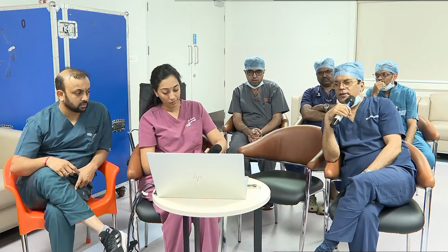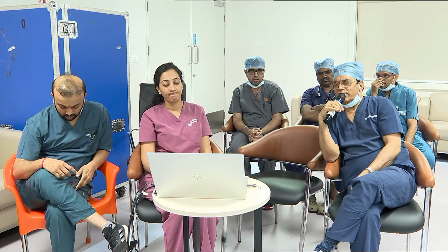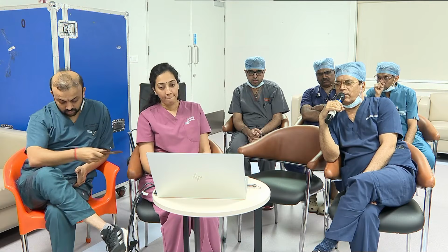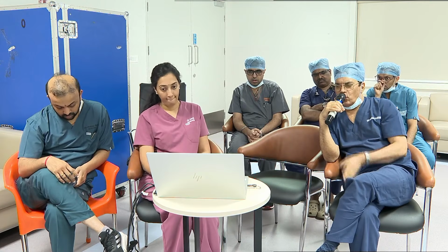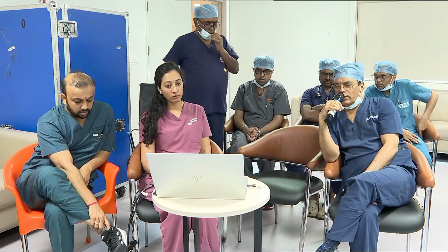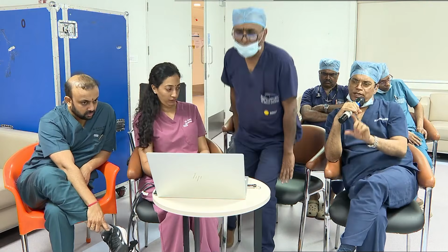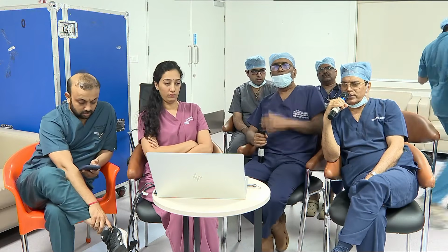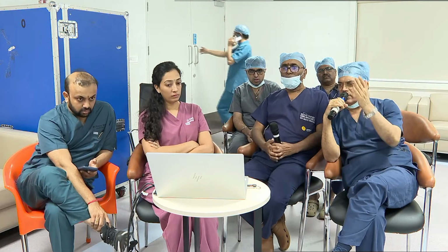Here the challenge is peripheral artery calcification, the severe peripheral vascular disease. If you see the aorta at the site of bifurcation, severely calcified. If you don't prepare well, what happens? Device delivery is very difficult. Manipulating, advancing is very difficult. Sometimes you may have to use the snare or you may have to use the buddy wire. These are all important to cross the valve. But here, once you prepare the lesion at the aorta level, that is before bifurcation, see, it made it easy. It was tracking very nicely.